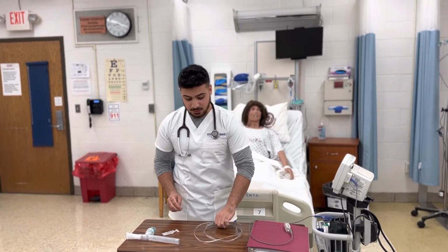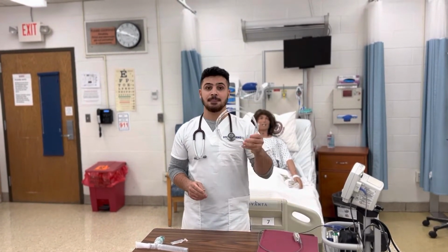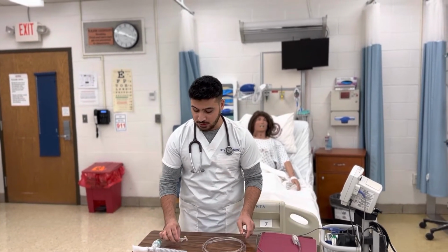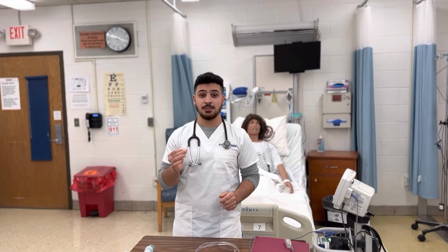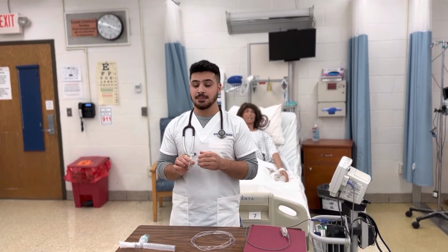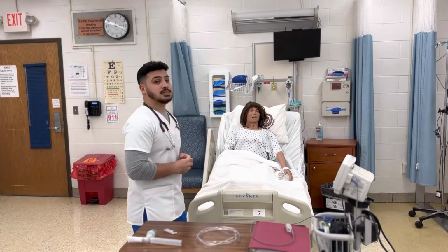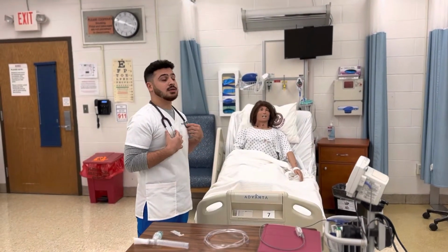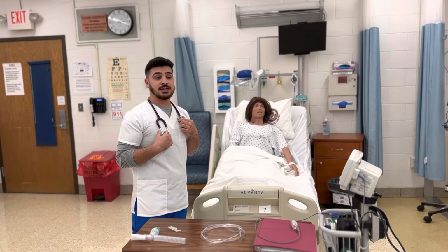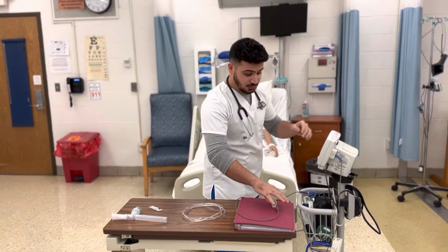For the third part, which is implementation or preparation, we're going to use the tube that connects the nebulizer to the oxygen tank, and we're also going to use the medication, which is albuterol. It's a kind of medication that helps the patient expand their lungs and breathe better. And the last step, which is education, we're going to educate the patients and demonstrate how to effectively inhale the medications. Let's move to the second step.